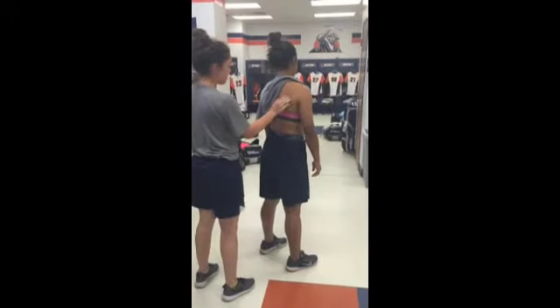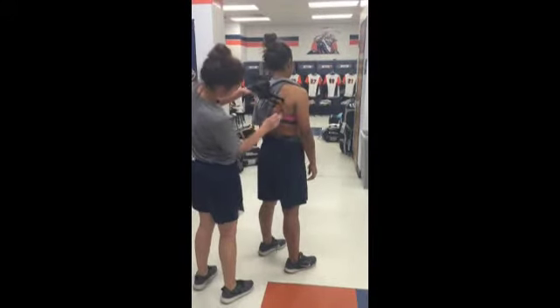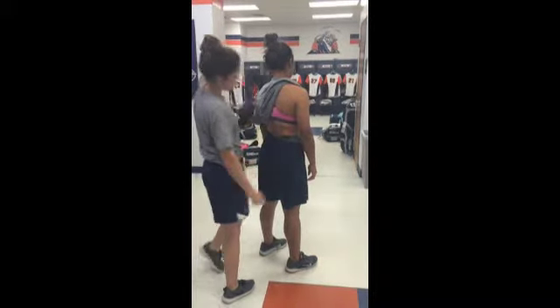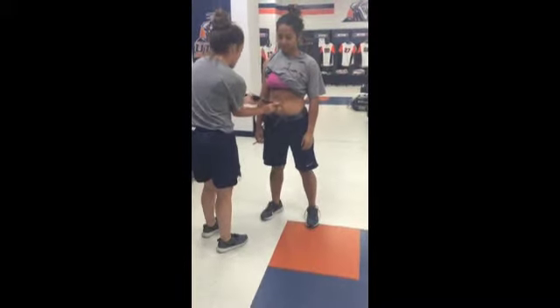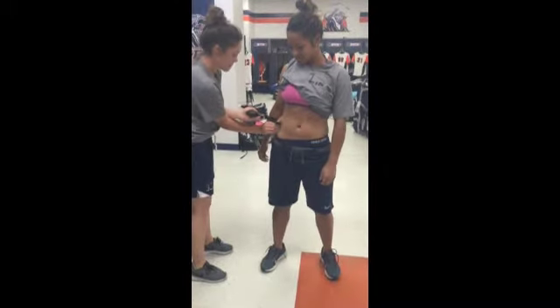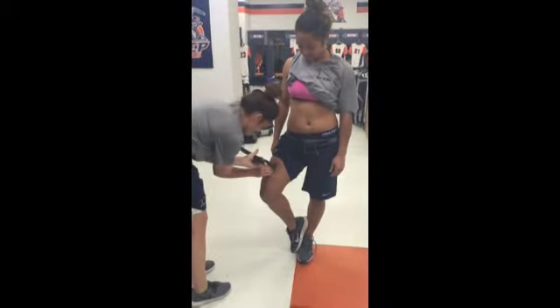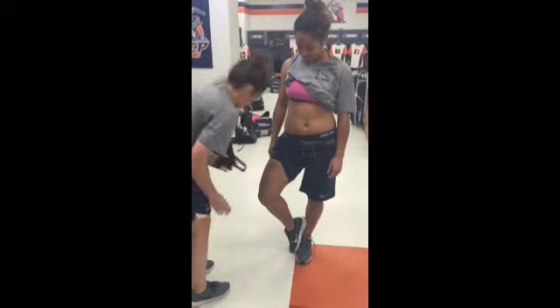This is the subscapular, which is a diagonal fold one to two centimeters below the inferior angle of the scapula. This is the abdominal skinfold, which is two centimeters to the right of the umbilicus, or belly button. This is the suprailiac, which is at the natural angle of the iliac crest. This is the thigh, which is halfway between the hip and the knee.